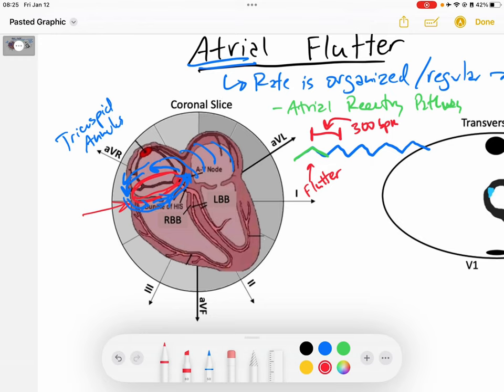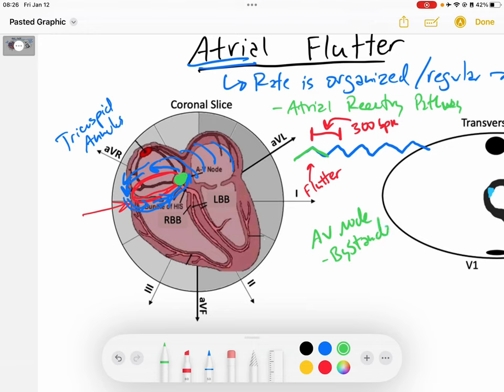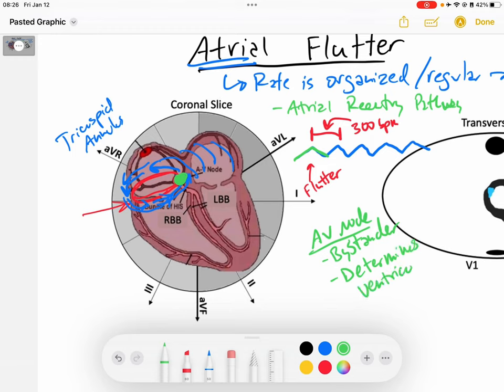When we look at atrial flutter, the ventricular response — which is our QRS — depends on the AV node. The AV node, which is sitting in the atria, is what we would call a bystander. Why is it a bystander? Because this is an arrhythmia arising from atrial tissue. Our AV node is going to capture that signal and send it down to the ventricles. The AV node is not directly participating, but it is determining the ventricular response.